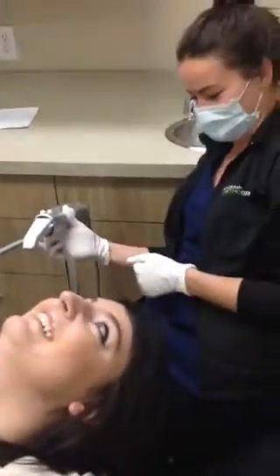So I'm going to leave that here. And it has a lot of air blowing out of there. That air is just going to keep your teeth dry and keep the lens dry. So that part kind of gets annoying. Your mouth just gets super dry, but that's it. And I won't make you go upside down. Sorry. It's okay.